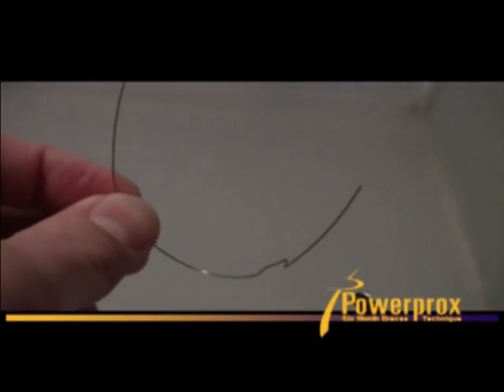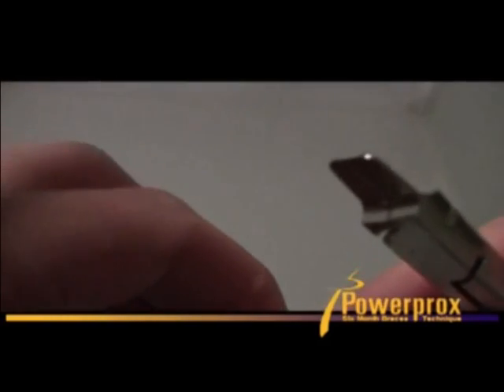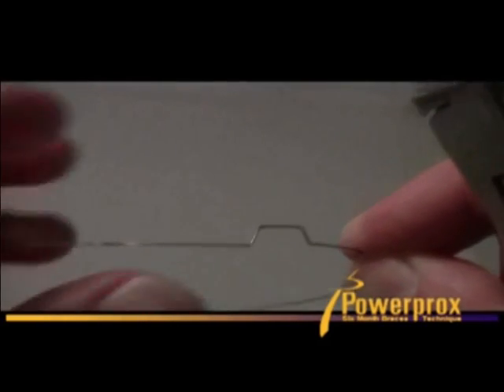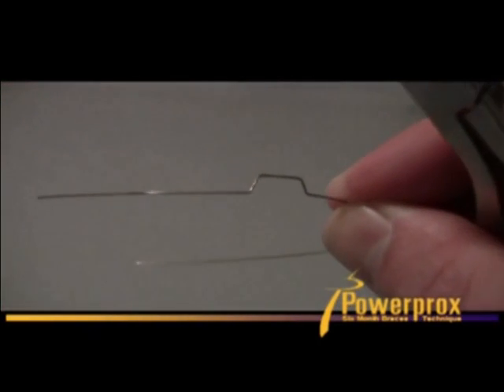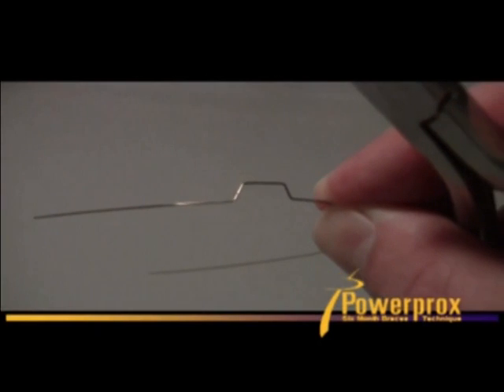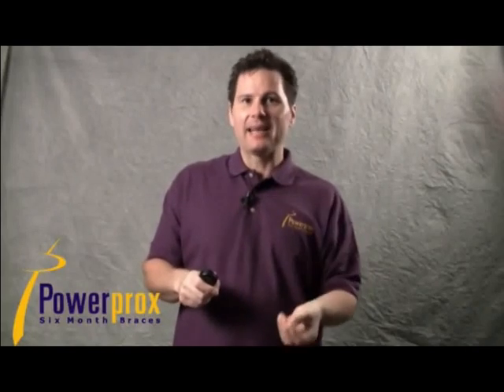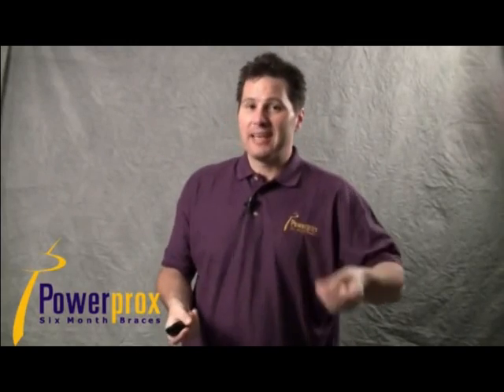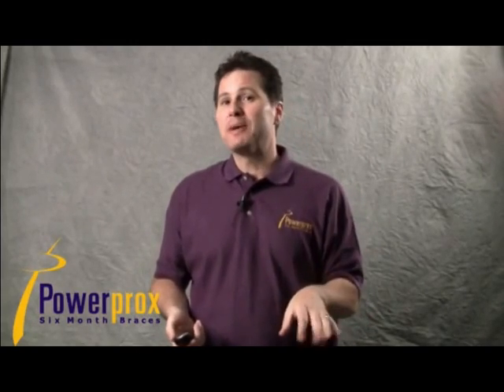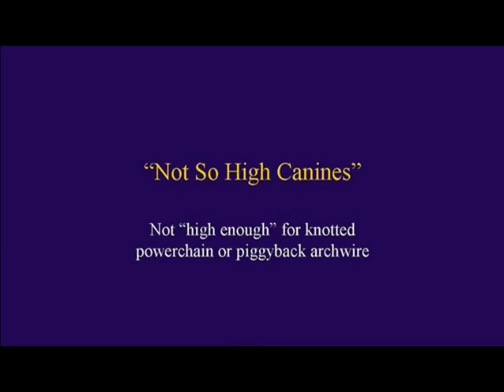And you can place open coil spring over that too to maintain that space, while you then have your piggyback arch wire going directly to the canine. So this allows that wire to still bypass the canine, but that big step bend creates that little window, so as the piggyback's bringing it down, it will not get in the way. That main arch wire is not going to collide with the cuspid, getting in the way of that final movement. Great little trick.